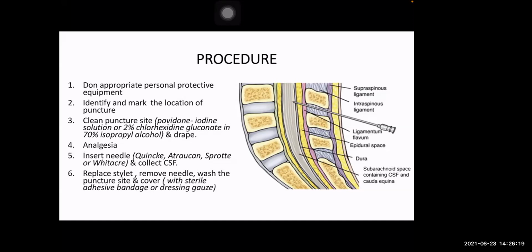And then once we are done collecting the fluids, we replace the stylet and remove the needle. Then we wash the antiseptic solution off the skin and cover the puncture site with a sterile adhesive bandage or dressing gauze.